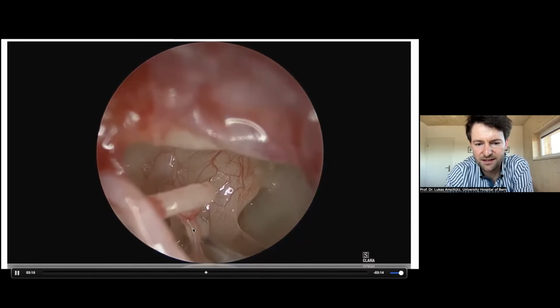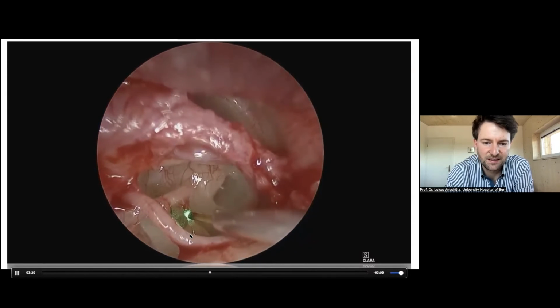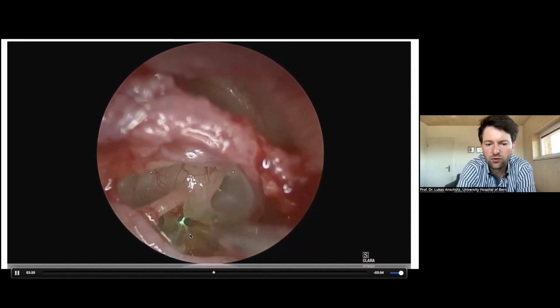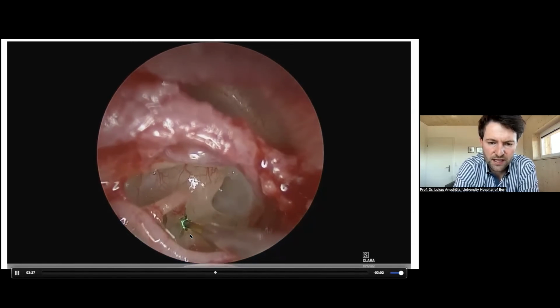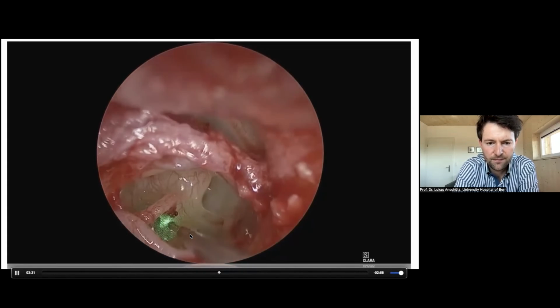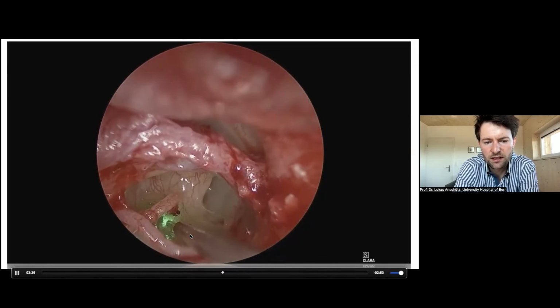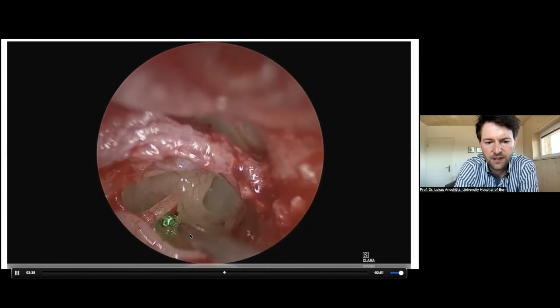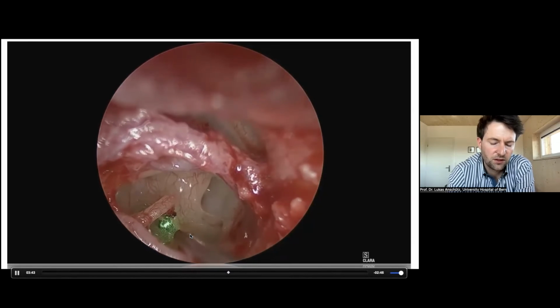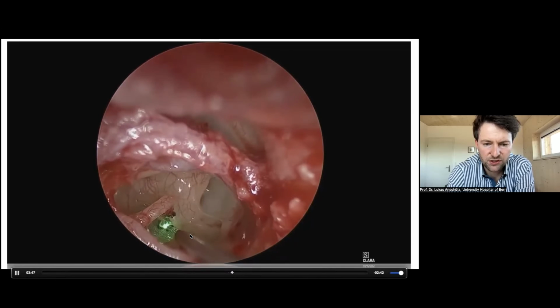The tendon is moving, of course, and the stapes not. Here I use a diode laser. You can also use only cold instruments, but I use a diode laser here to cut through the tendon. And you can use the diode laser also to cut the posterior crus. Here you can see, you can cut the bone using the laser. You can also do it with a micro drill or some crura scissors.